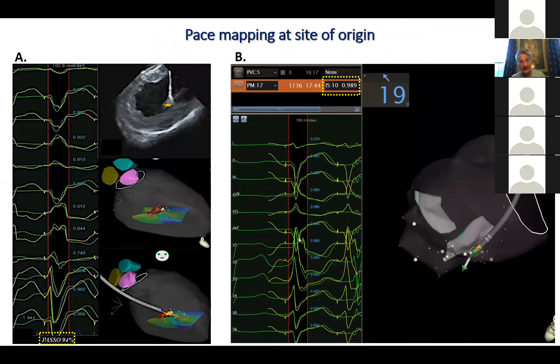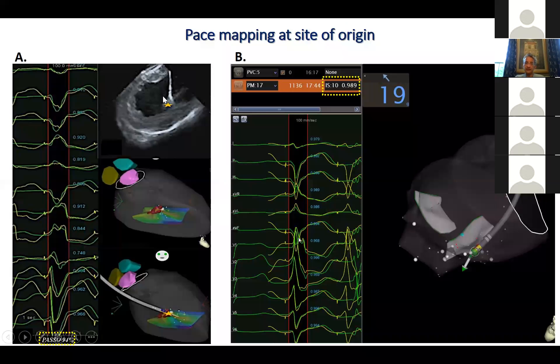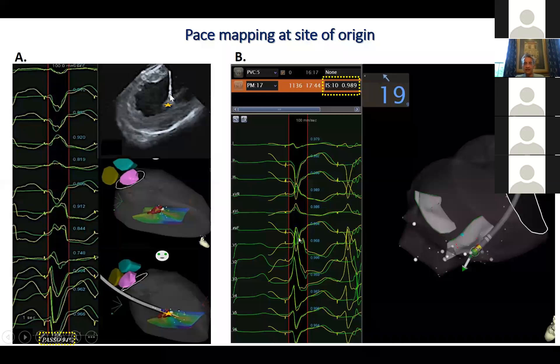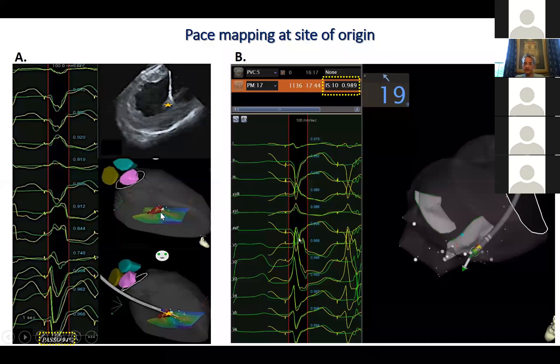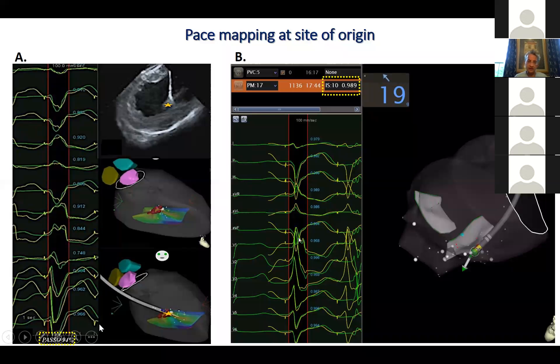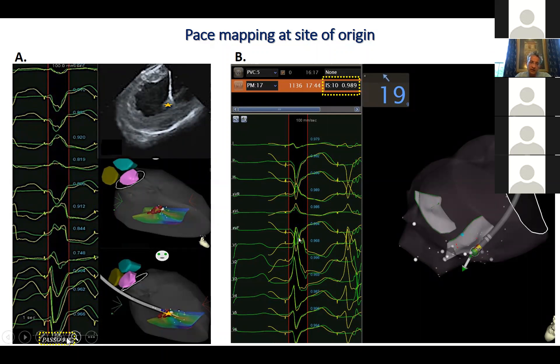Pace mapping can be helpful, but it's really not your primary tool. Here are two examples. The first is the papillary muscle - a posterior medial papillary muscle - with the catheter right on the body. That was the site of earliest activation. The pace map there, using the proprietary algorithm that Carto has, where they do a match and give you a percentage of how close the match is to the native QRS, was about 94%.